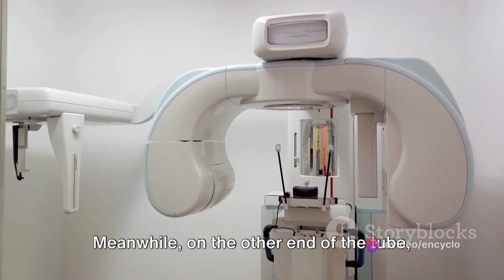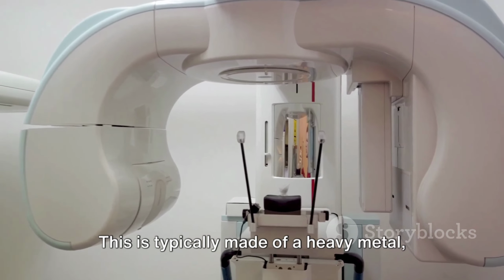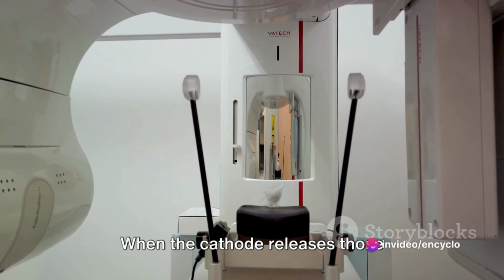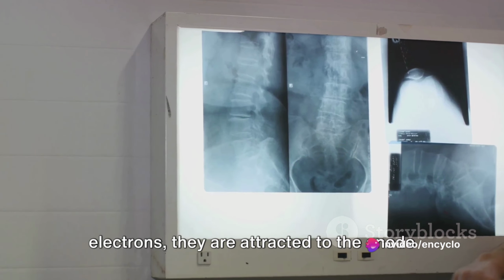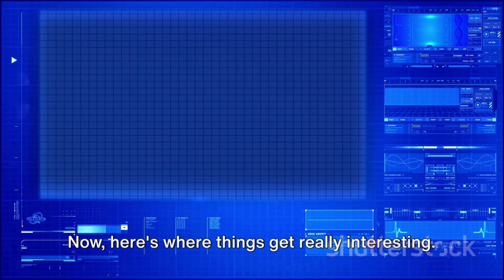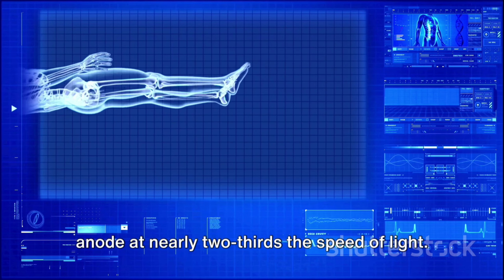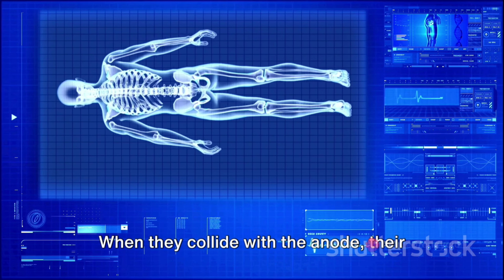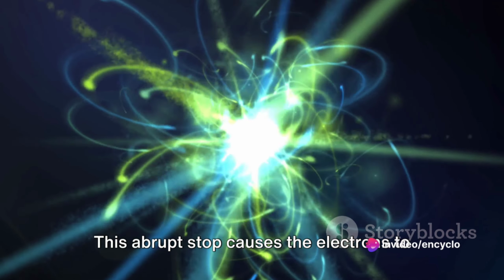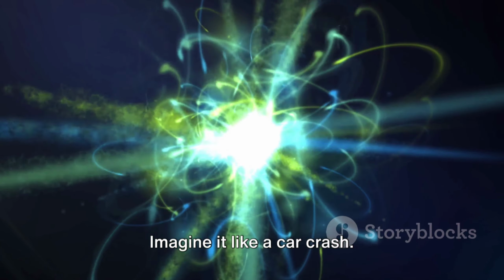Meanwhile, on the other end of the tube, we have the anode or positive electrode. This is typically made of a heavy metal, like tungsten, which has a high melting point. When the cathode releases those electrons, they are attracted to the anode due to the difference in charge. Now here's where things get really interesting. These electrons are racing towards the anode at nearly 2/3 the speed of light. When they collide with the anode, their high-speed journey comes to a sudden halt. This abrupt stop causes the electrons to release their kinetic energy in the form of X-rays.